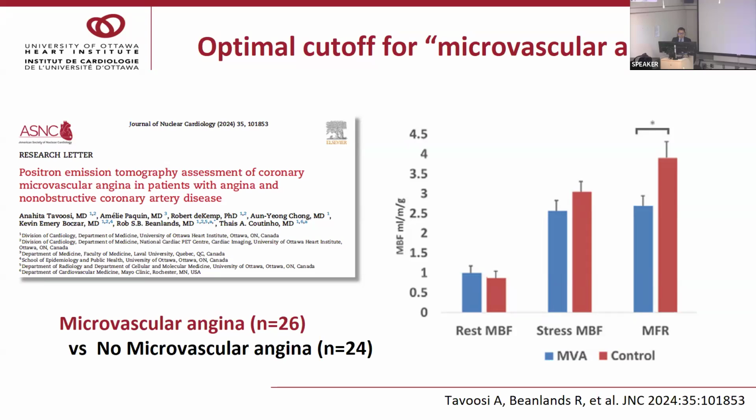So this result makes me wonder whether the MFR cutoff should be defined in each patient population with the clinical context. So in my mind, using a single cutoff like 2.0 would not be reasonable, but of course, this needs further evaluation.